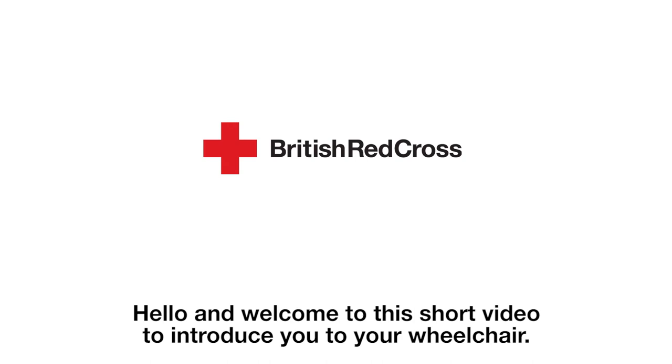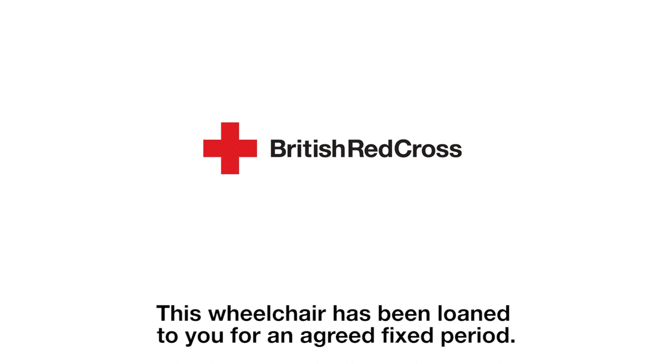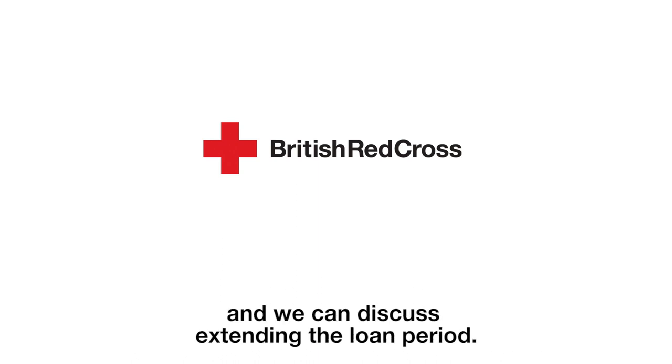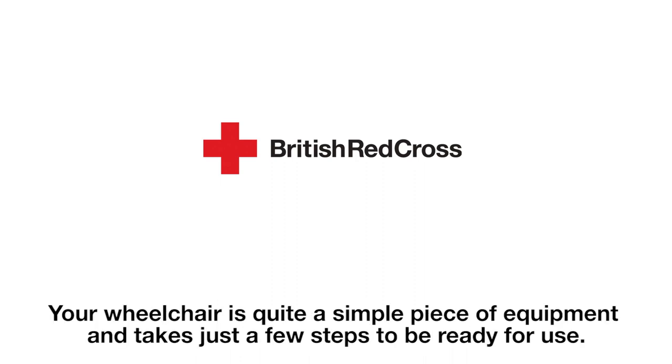Hello and welcome to this short video to introduce you to your wheelchair. This wheelchair has been loaned to you for an agreed fixed period. If you require it for longer, please contact us as soon as possible and we can discuss extending the loan period. Your wheelchair is quite a simple piece of equipment and takes just a few steps to be ready for use.